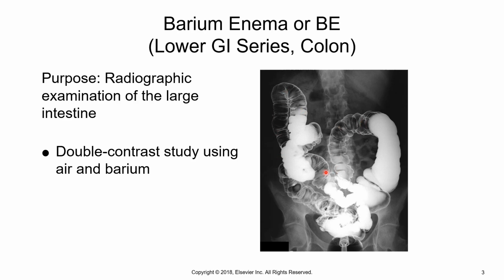So you can see that you tend to use the barium to outline the wall of the intestine. You can see the haustra all outlined in here, and then the positive contrast media fills the other sections, and the radiologist can move that around depending on when it's going in. And then with the compression paddle, you can see here the retention tip. This is the enema tip right here, and this is the retention balloon inflated.